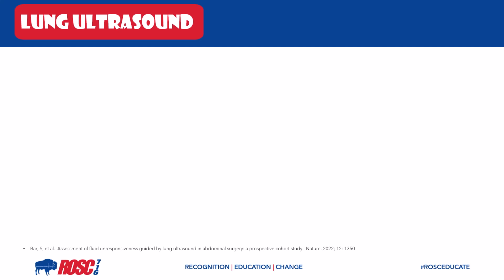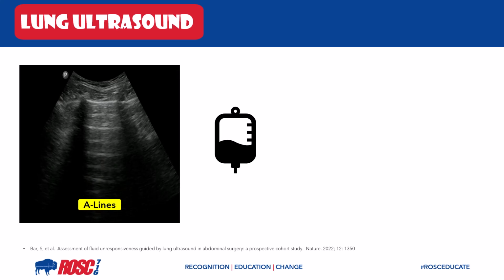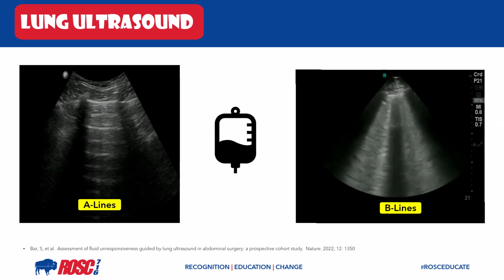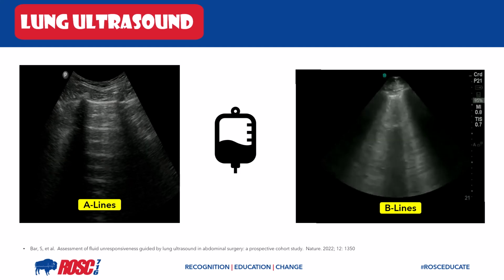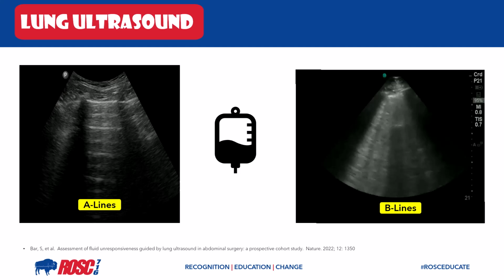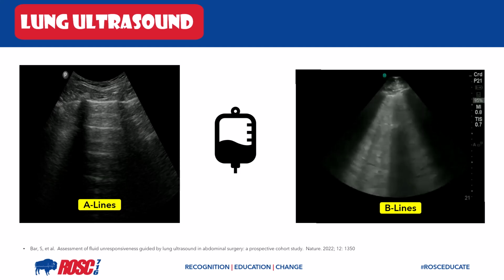The patient's admitted with septic shock secondary to urinary origin. Your lung ultrasound assessment prior to administering fluid demonstrates A profile, A lines. After 2 liters of volume resuscitation, you repeat a lung ultrasound, and now it demonstrates type B lines. The significance here is that your patient changed from an A profile to a B profile secondary to fluid resuscitation. This indicates early subclinical interstitial syndrome, i.e. pulmonary edema / capillary leak.